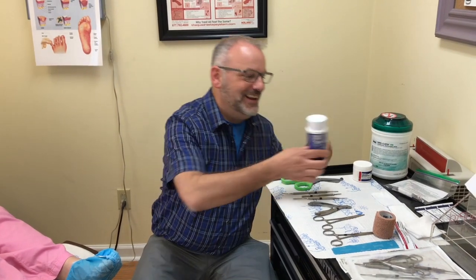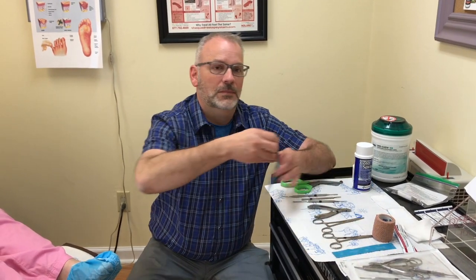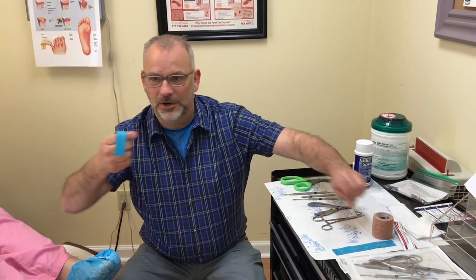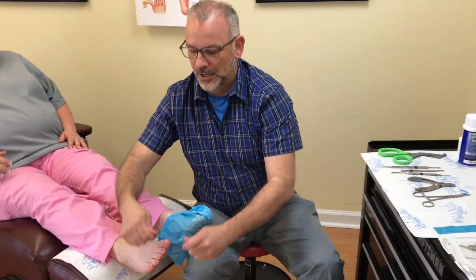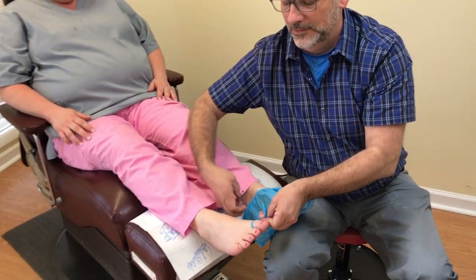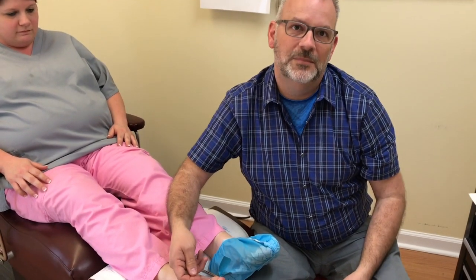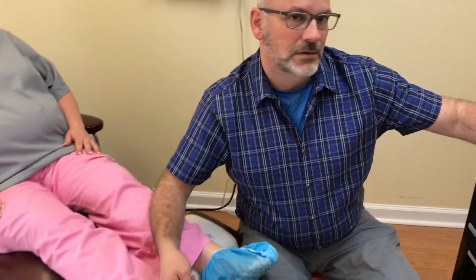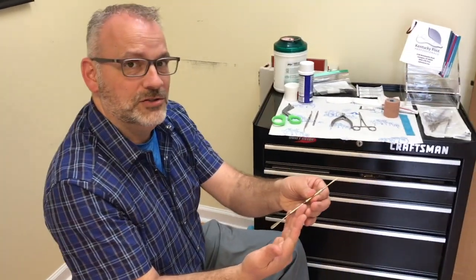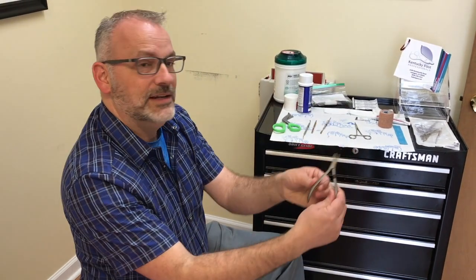You don't have to look at it any longer. But I'm going to just show you in general, after I numb the toe, we would take a small tourniquet, apply it to the toe and around, secure it with a clamp, and then use different instruments to free up the side of the nail, from a little freer or spatula, a dull instrument, to specialized nail splitters.